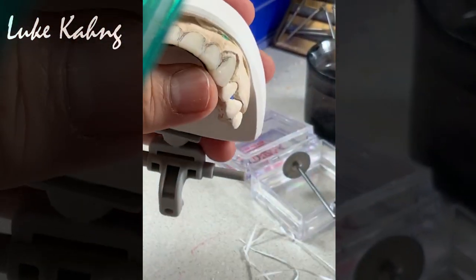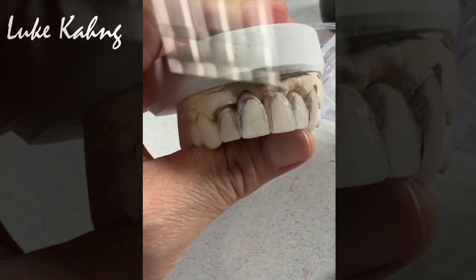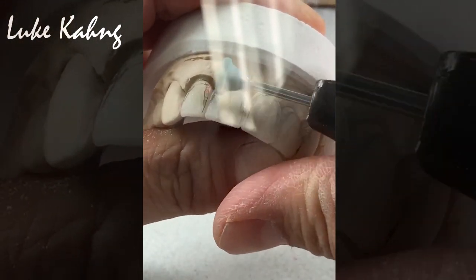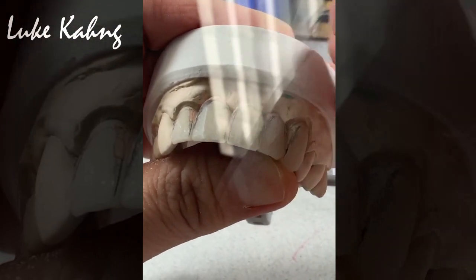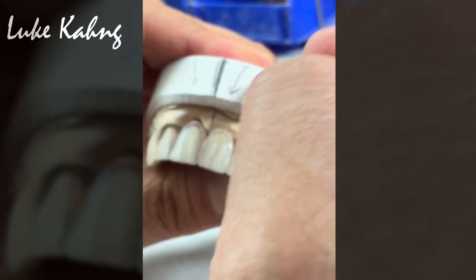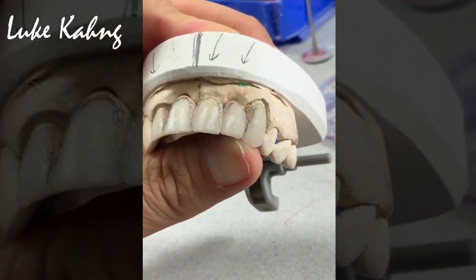Now same thing. Okay, number two, grinding. So you have to come here. Right. Grinding like this. Alright, remove it. So what I'm talking about, we should have to cut it here, but the impression is in the middle line. I don't like the reflection. Yeah, good. And then I move to this. This we call long axis. Makes sense? So I grind in that direction.